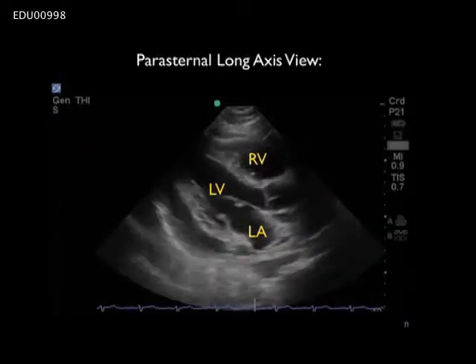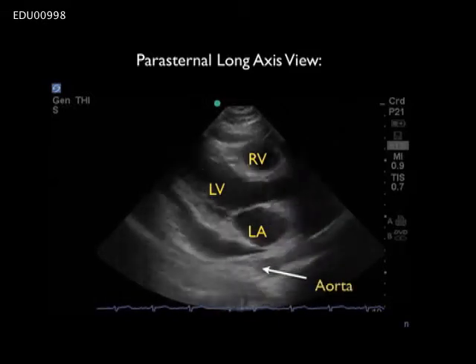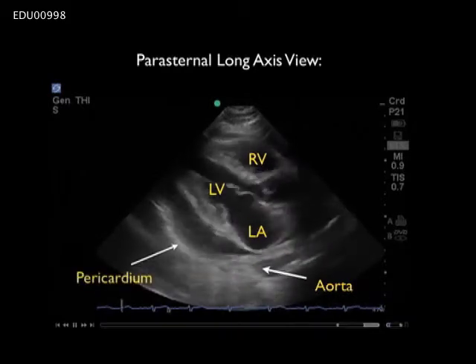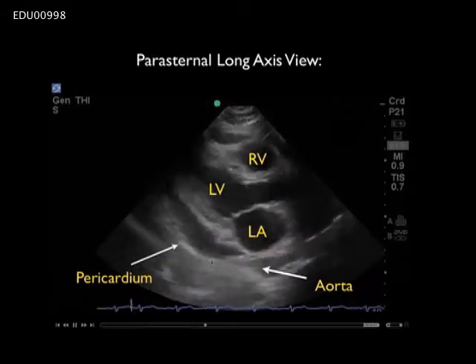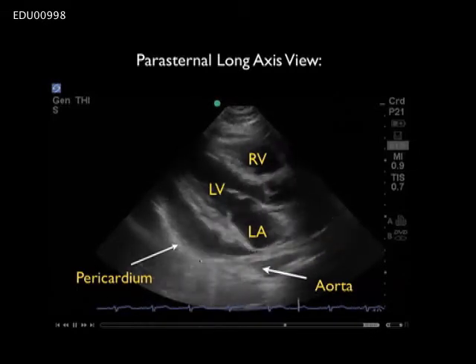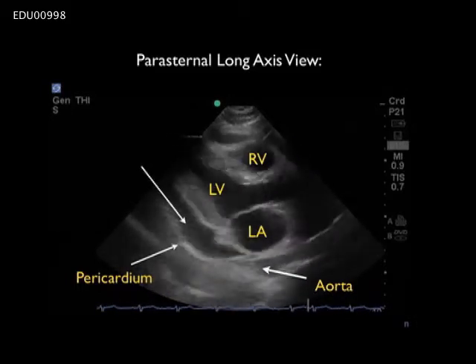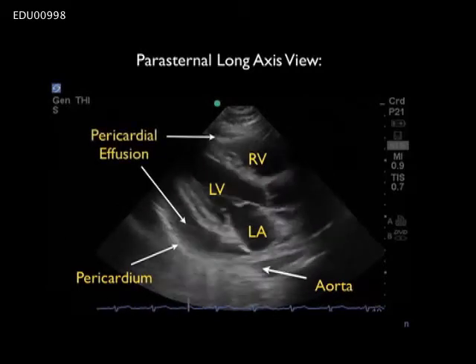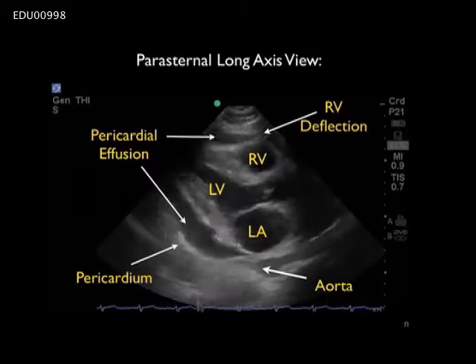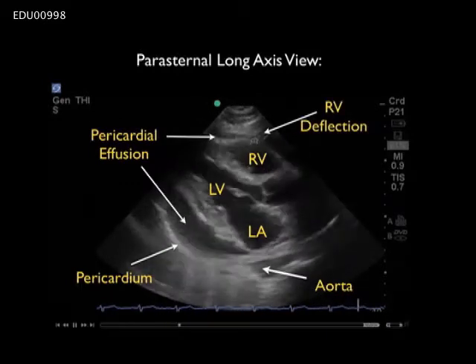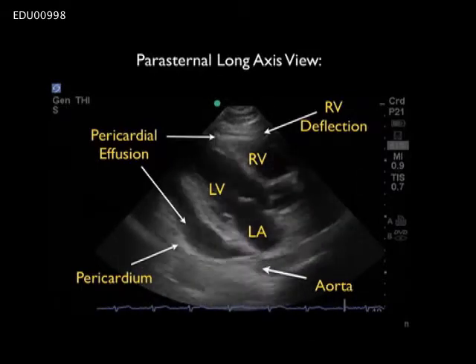Now that we've learned how to determine if fluid is pericardial versus pleural, let's look at this video clip. We identify the descending aorta and posterior pericardial reflection and confirm the fluid is anterior to both — and therefore pericardial. The next step is to look at the right ventricle for diastolic deflection that could indicate early tamponade physiology. We can see fluid both anterior and posterior to the heart, and we notice a serpentine deflection of the right ventricle that is worrisome for early tamponade physiology. This patient's blood pressure was noted to be decreasing on serial evaluations.